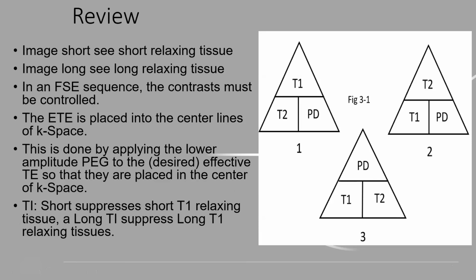Okay, so if you can get a visual on these, it's going to help with what TRs and what TEs. So when you start, you might say to yourself, oh my God, what if they ask me what TR I should use for T1? I really don't think they're going to ask you a specific TR. They might ask you a range at 1.5 Tesla. They might say, well, what range of TRs would be best suited for T1? Well, hopefully you already know around 400 to 750 is a good range for TR for T1 at 1.5.